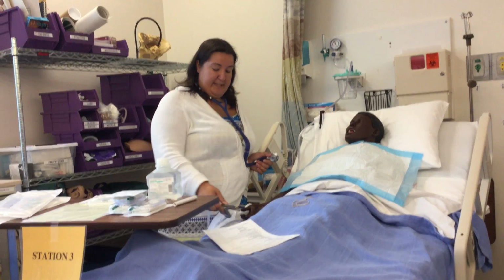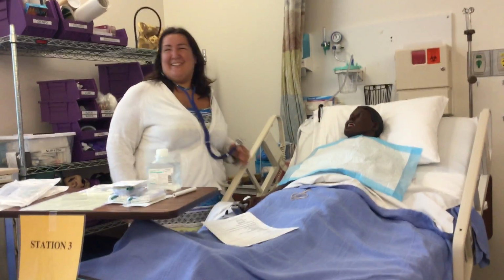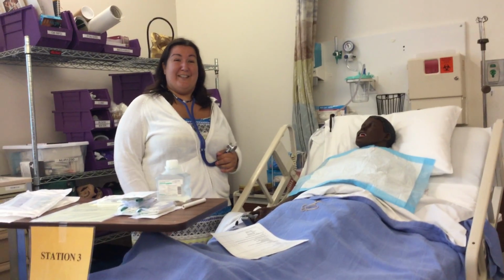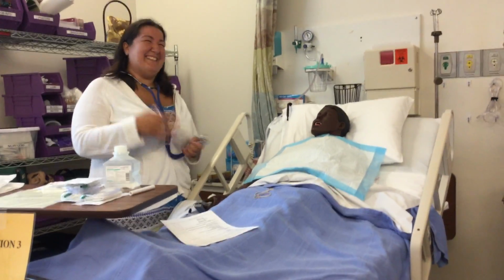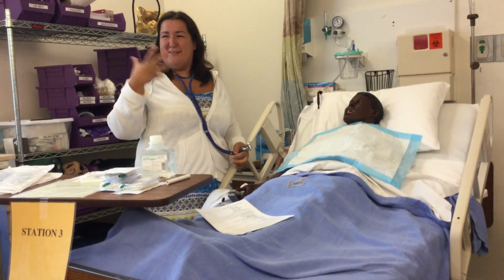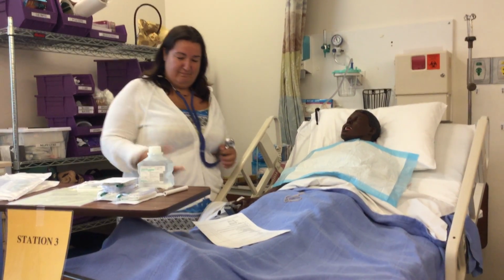So you're going to see that drop, and you also want to put it on there because you don't want them to go too low. If you're suctioning too long, you're going to see that start to drop, but that's not good. That means you're blocking their airway and they're not getting oxygen in. Especially when you're doing trach, because when you put a suction catheter into a trach, what are you doing? You're occluding it. So with the nose, you have the other nostril to breathe out of, unless it's clogged up. But when you go into that trach, they're not breathing for that period of time because you've got that in there. So just be aware of that.